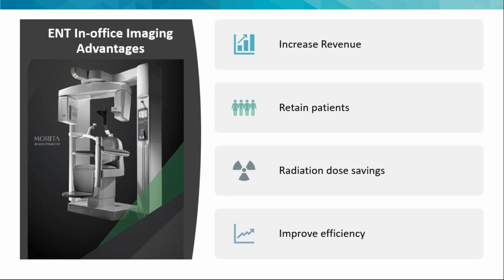Yeah, and I should point out that is approximately the same dose as a lateral chest radiograph. So a PA chest radiograph is 0.03 millisieverts, lateral chest radiograph 0.17, so 0.2. So we're talking about the ENT CT scan being approximately the same dose as a chest PA and lateral. Slightly lower in some cases, right? It can be. So, like I said, there are a lot of different advantages to utilizing dose more efficiently in cone beam.